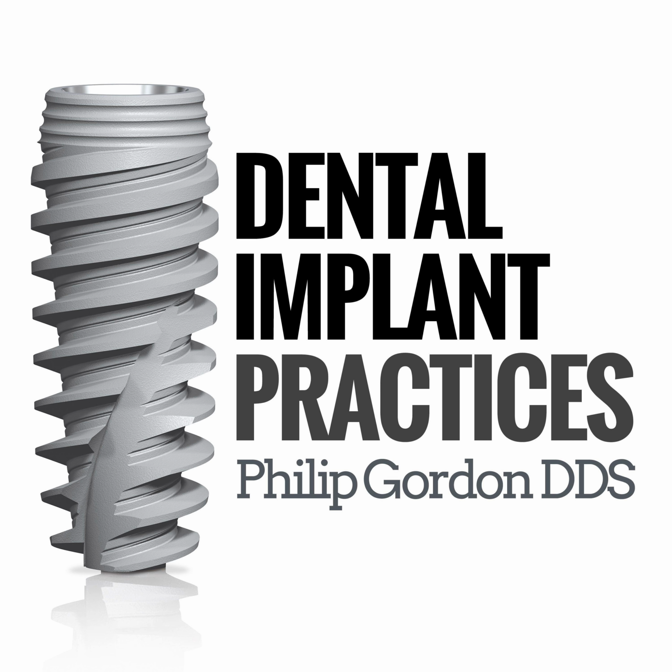So at this point, one must decide: are you going to place the cover screw or the healing abutment? If the surgery goes as planned and I have adequate keratinized tissue, the patient is healthy, and I have adequate bone and proper insertion torque, I like to go straight to the healing abutment. However, if there is insufficient bone and I need to place bone augmentation around the top, or if there's inadequate keratinized tissue, or the patient has compromised health, meaning some level of gingivitis or periodontitis, or is a smoker or a diabetic, or has compromised immunity healing, then I like to do a cover screw and close the site back up.